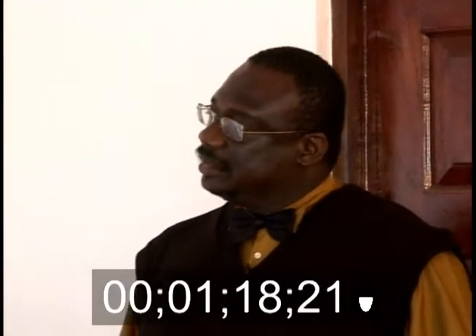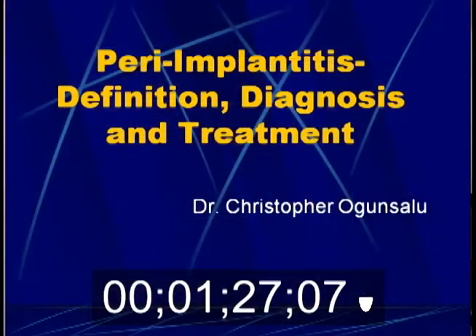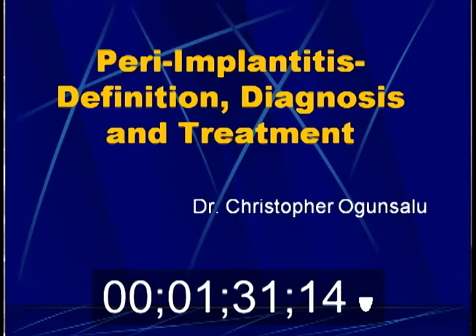And one of the techniques I want to teach you around failing implants is that you can actually use the implant to stabilize the membrane, put bone graft under it, and then tuck it around, and it works really well. All right?